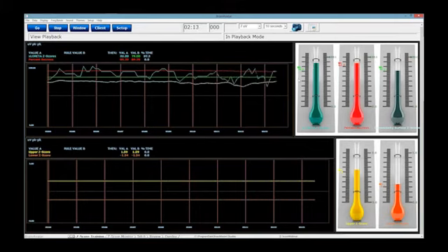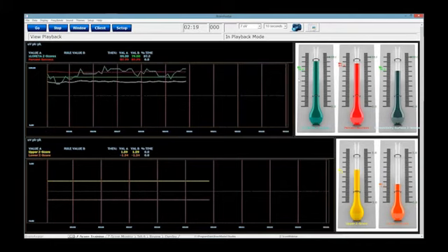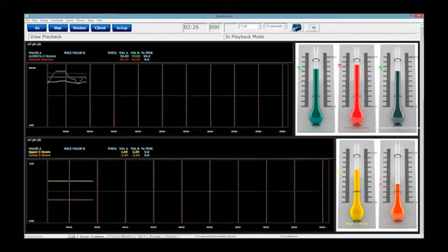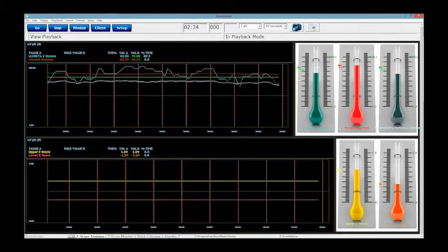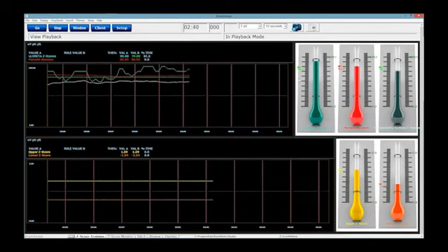All right. And so, like I said, when this protocol is going to be available, and I'm hoping to get it released soon, I want some clinicians to actually double check it more before I say it's going to do what I want it to do. As I'm a technician, I have theories on how things should work and how they should be, but I cannot actually give any technical advice, so a clinician will probably be looking at this before it actually gets sent out for demonstration purposes. But that's the technical backing of the Z-scores.